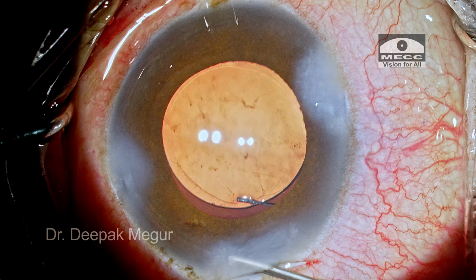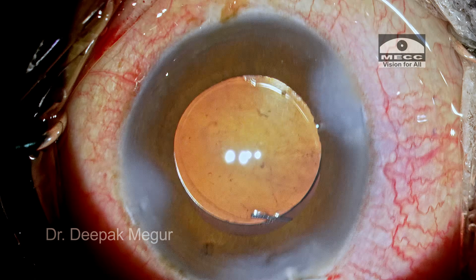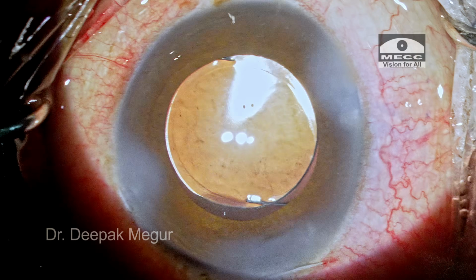Well, the bigger question: why did it prolapse? Well, I don't have any answer for it. We asked the patient for any history of injury in the past. It wasn't there. So we do have to live with some surprises which remain unexplained. So that was it.